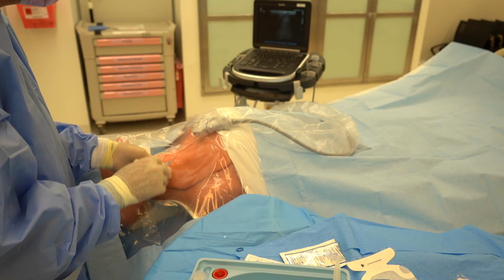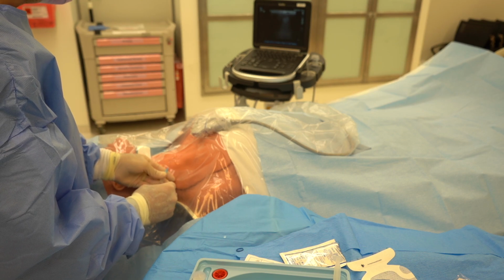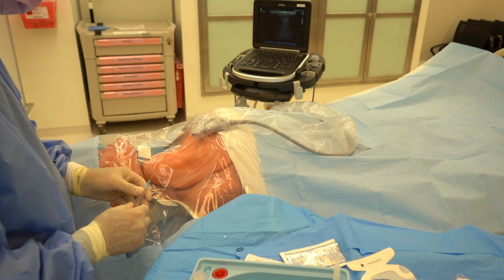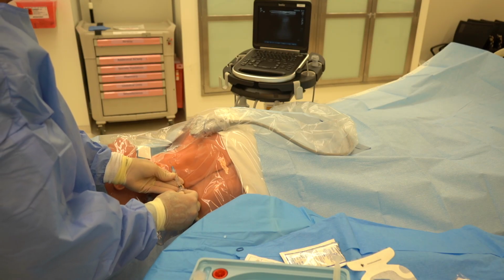We'll see that wheal expand out. We'll let that sit for about 15 to 20 seconds or so. You'll see here I'm making an additional wheal where I anticipate the suture to be for the catheter, and I'm going to use that wheal to make a secondary wheal across to where the other suture site will be.